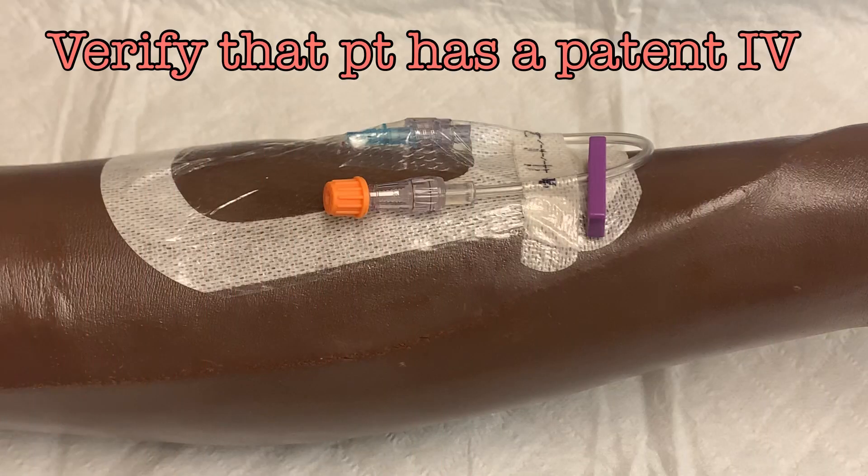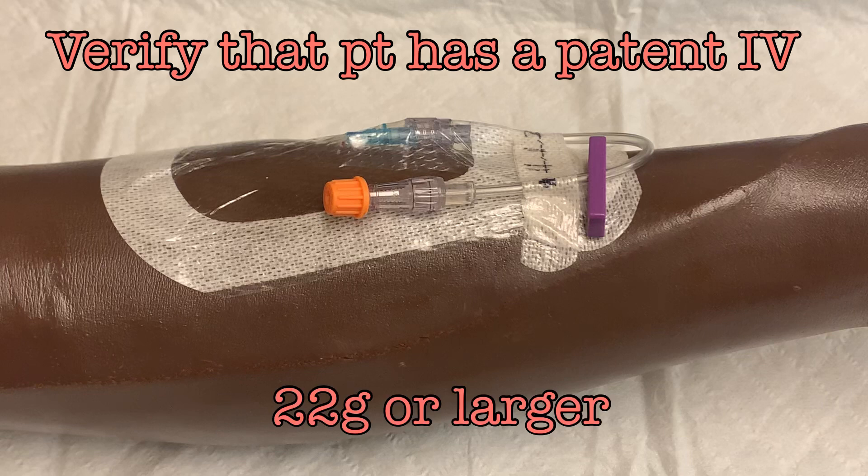But before you release that blood, there are some tasks that must be completed. Verify your patient's IV access — the patient must have an IV. A 22 gauge is the minimum requirement, but larger gauge IVs will flow more smoothly.